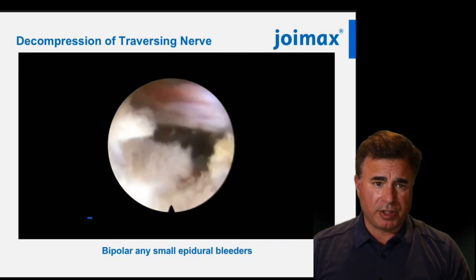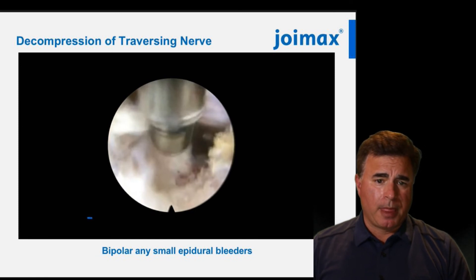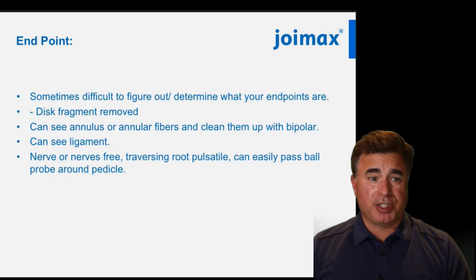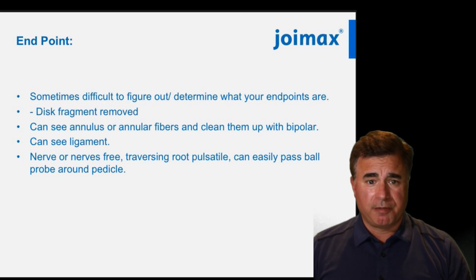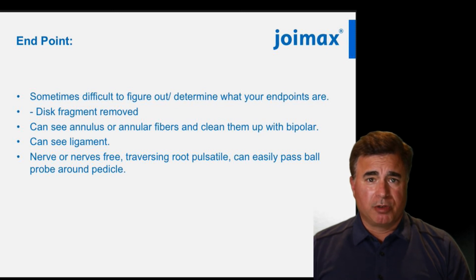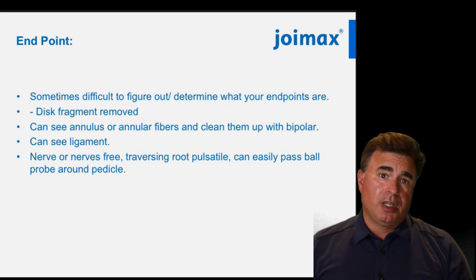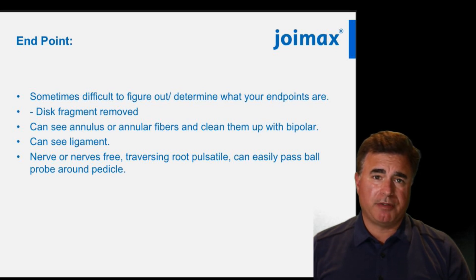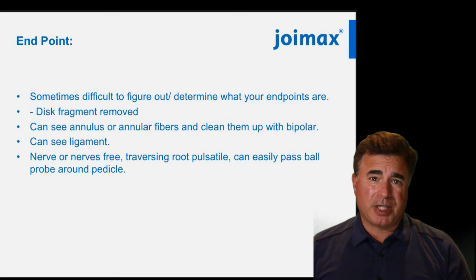In this case you'll bipolar any epidural venous bleeding, and your surgery at this point is done. Which begs the question: how do you know when surgery is done? I use the same criteria that I use in open surgery — it's something you learn over time. Once you remove a very large fragment and see that the nerve root is free, your operation is done. Sometimes I have to enter the disc space, and I use the same criteria as open surgery, mostly by feel.